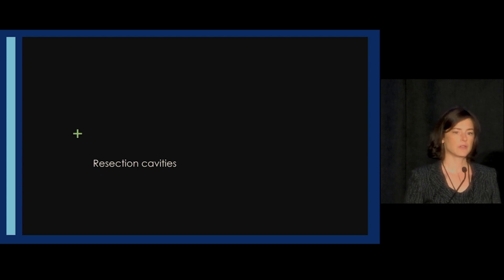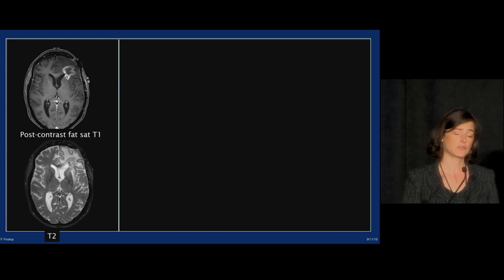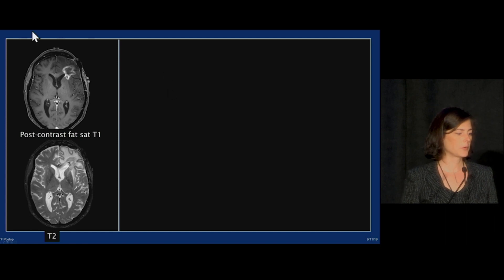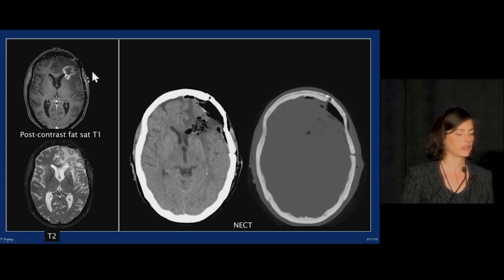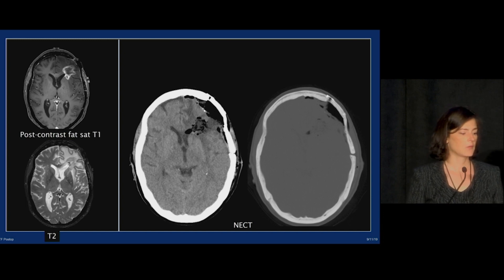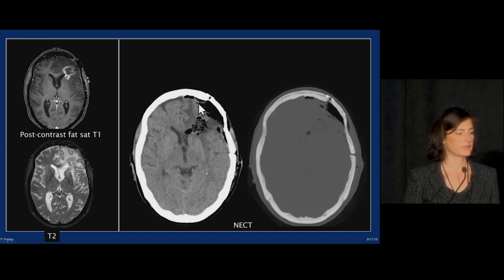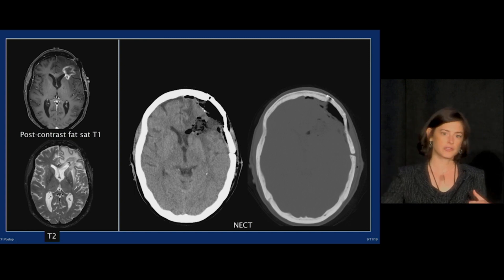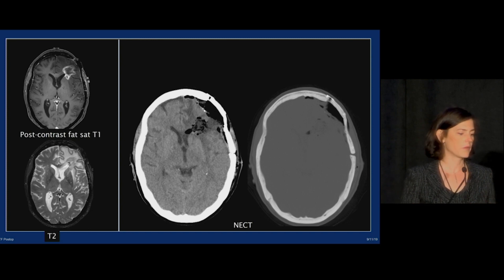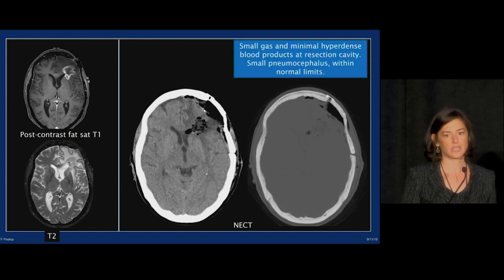Now let's talk about post-operative resections. In the ED, you might be asked to read these post-op films if a case ends late at night. This person had a glioblastoma that was resected and presented back with a mass — it wasn't clear if it was glioblastoma or radiation necrosis, so they decided to take it out. On the initial post-operative CT, we see pneumocephalus, a resection cavity with gas, and a little hyperdense material along the brain surface — blood products, Surgicel, hemostatic material — all within normal limits. This is what a resection cavity should look like.